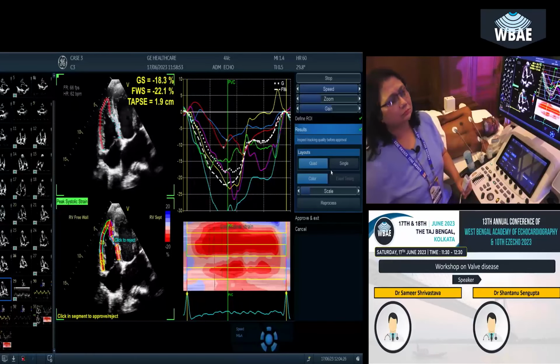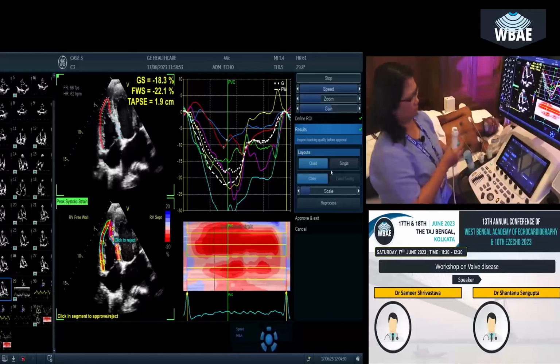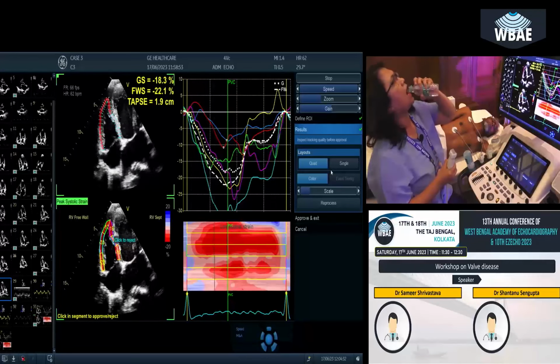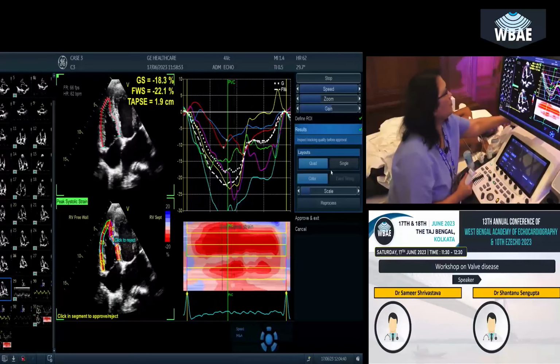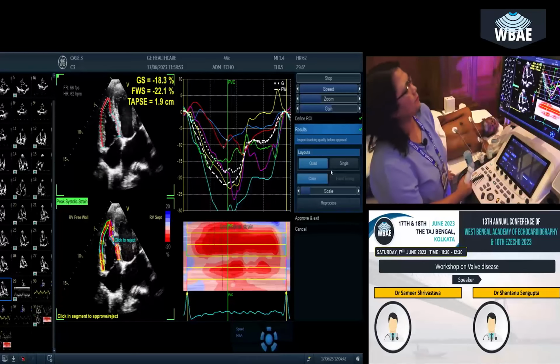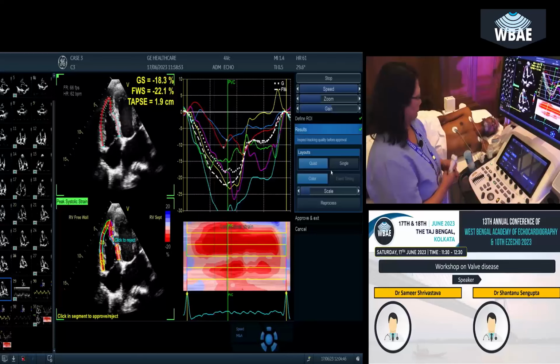Do you do MAPSE routinely? No, we don't do MAPSE routinely, but the Critical Care Society is doing MAPSE routinely in ventilated patients. So they are now suggesting that we should do MAPSE, because I was talking to critical care guys over here. So we have better indices.